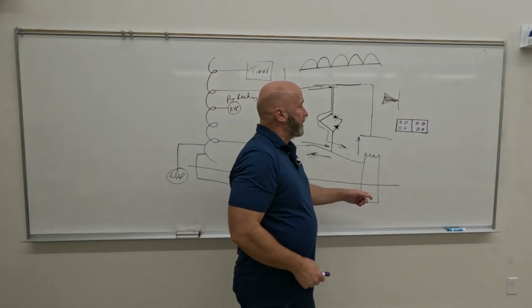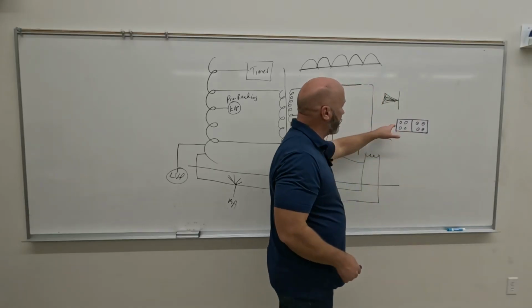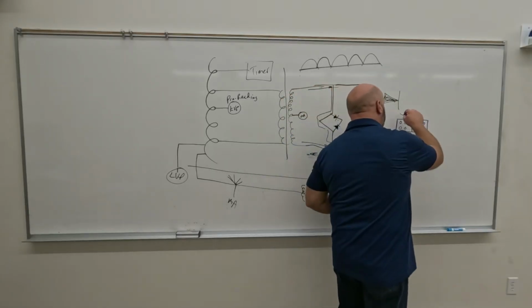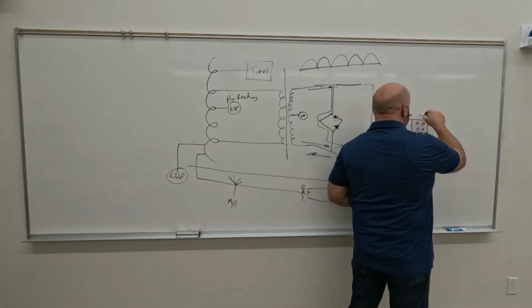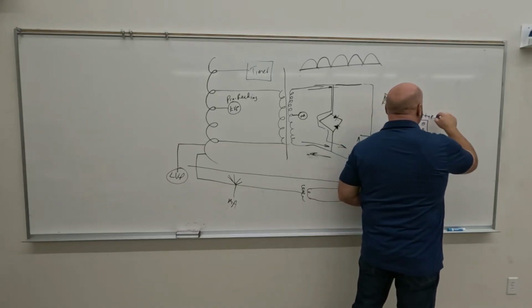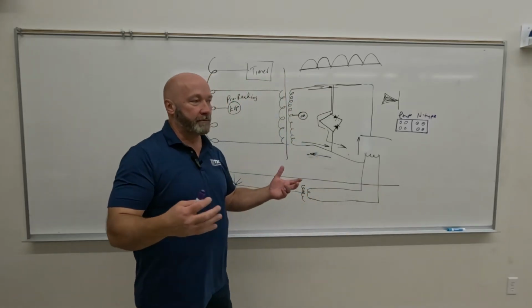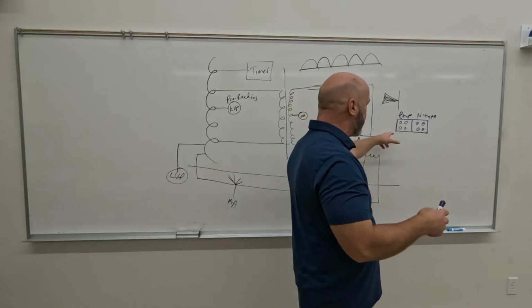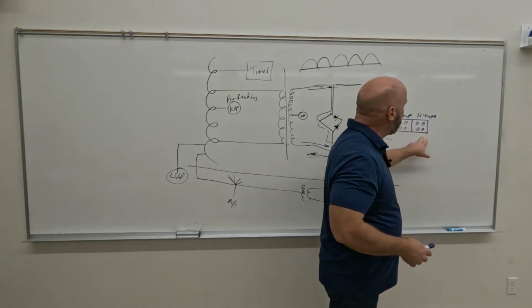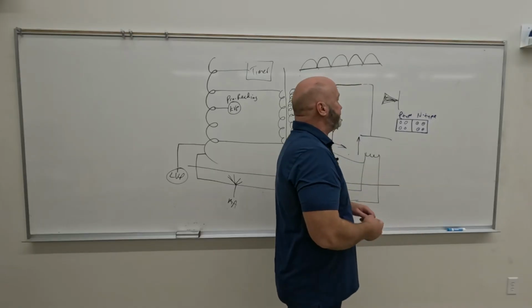Okay, so we marry those two together at this junction in between them, and we're going to call this side the p-type, and this the, because those are all negative, n-type. So again, one of the few things in X-ray that actually makes sense. We've got p-type because we have electron holes. Let's imagine that we just don't have enough electrons. And the n-type, we've got too many electrons, okay? So think of it that way.